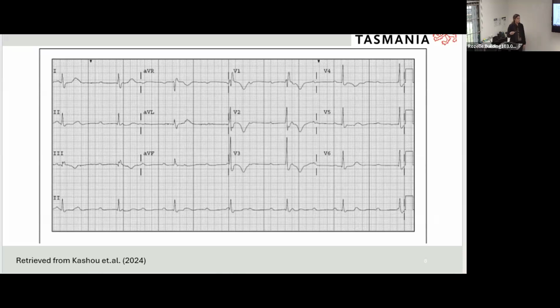Obviously the machine does a lot of interpretation for us, but I would probably agree with you, Michael. I'm a bit more in favour of the 6-second method for exactly that reason, that you can navigate the irregularity of the rhythm pretty quickly. The only time is if you have, well, if you have bradycardia being that bad, then you're going to be putting the pads on anyway, but that can also make it difficult. So doubling the method as well can also work.